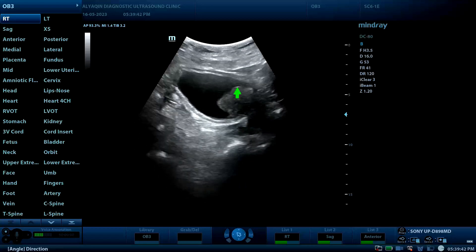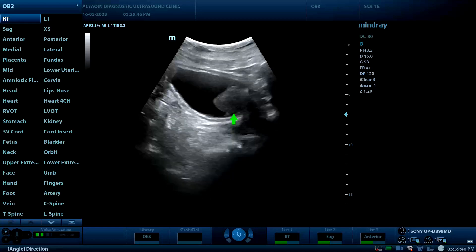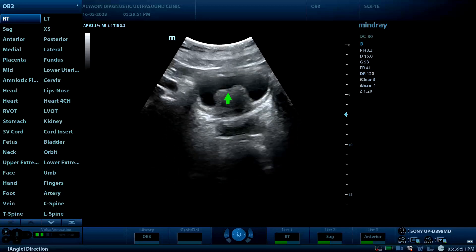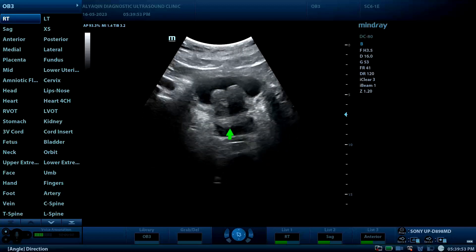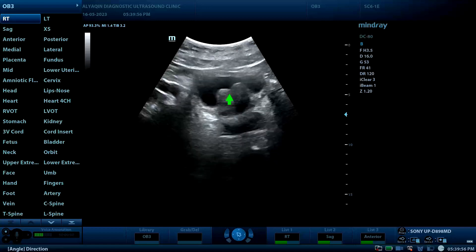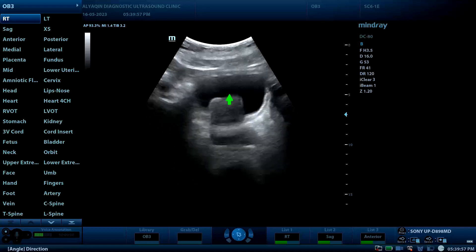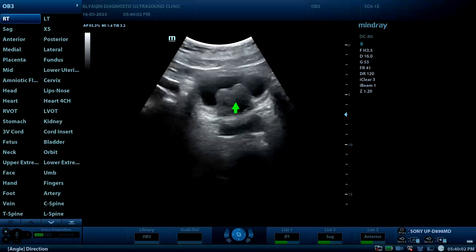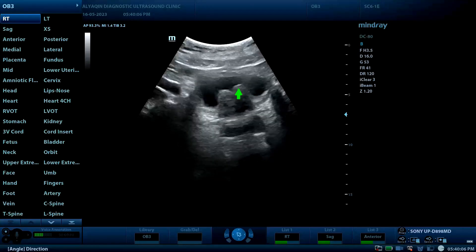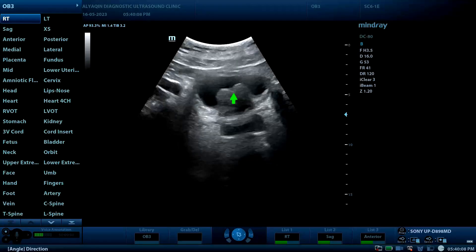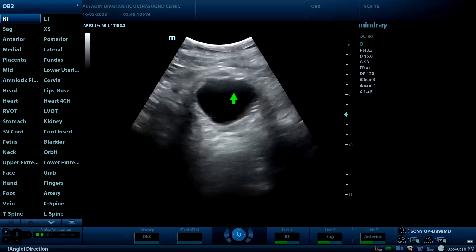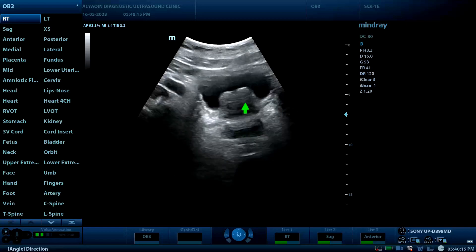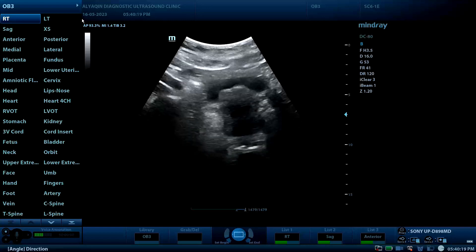There is a filling defect in the bladder at the basal wall. However, in cross section, it is continuous with the prostatic gland — this is part of the median prostatic lobe projected toward the bladder cavity, representing enlargement of the median lobe of the prostatic gland.